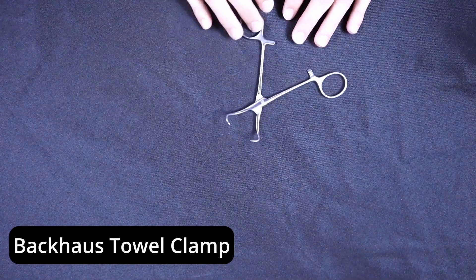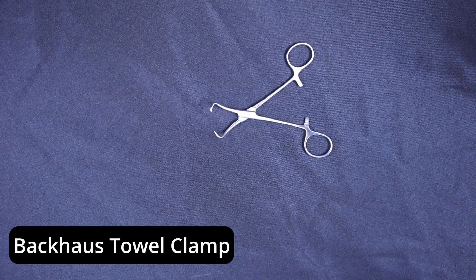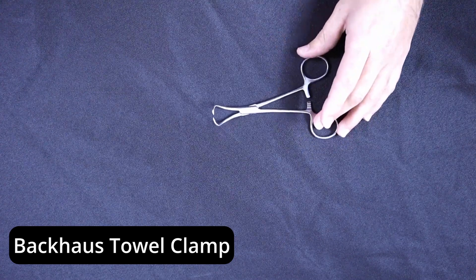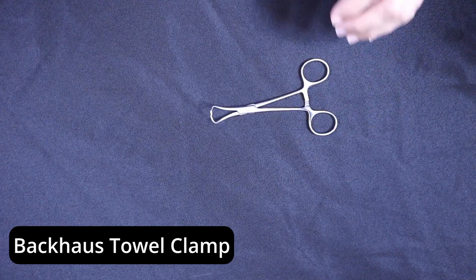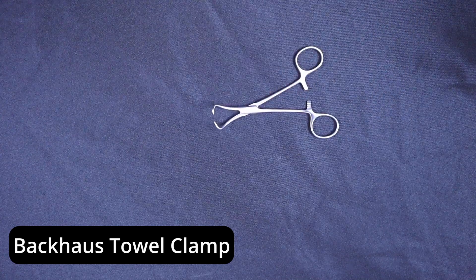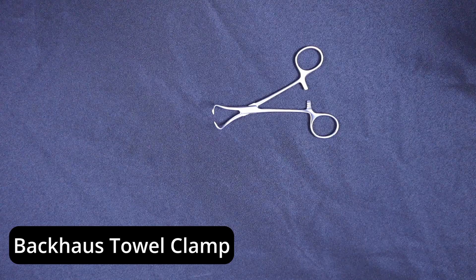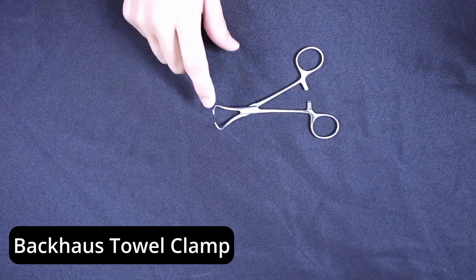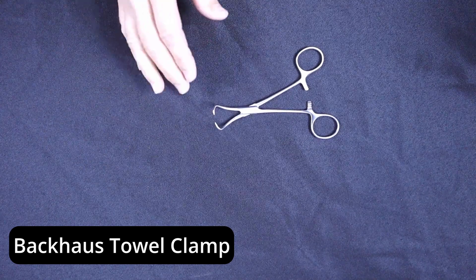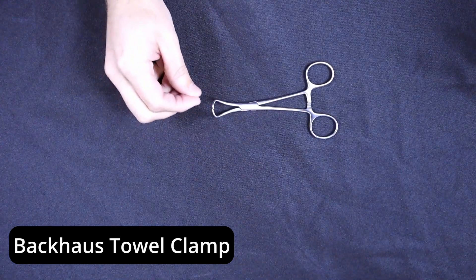So be very careful on any tray that you learn has a towel clip or towel clamp inside of it. Even though this model is not a non-perforating — this is clearly a perforating model — there are non-perforating towel clips. If you see those, they will have blunt edges on the tip, and oftentimes they look like little squares that will come together, rather than crossing like this — they'll just come and touch.